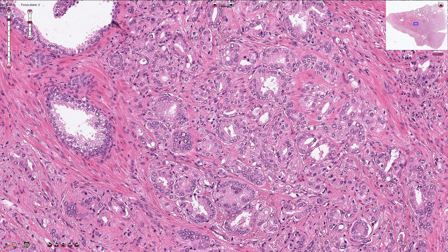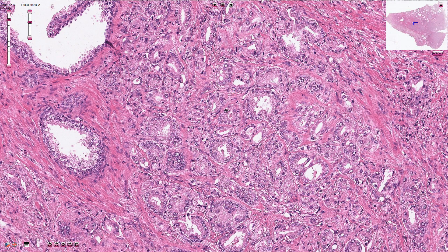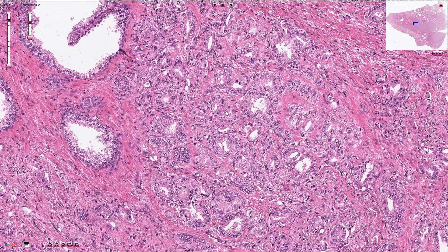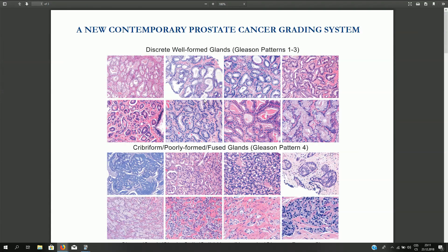According to the architectural patterns we can grade prostatic adenocarcinoma. Traditionally we use the Gleason grade, and according to the latest WHO classification we also use grade groups. The Gleason grading system is widely accepted and based on glandular architecture patterns. Usually at low or intermediate magnification we can classify the carcinoma into five basic grades.